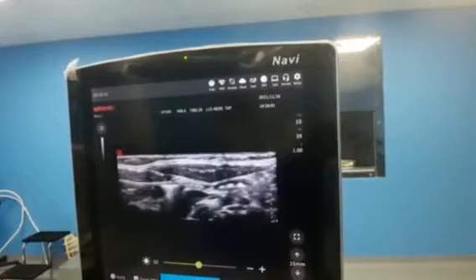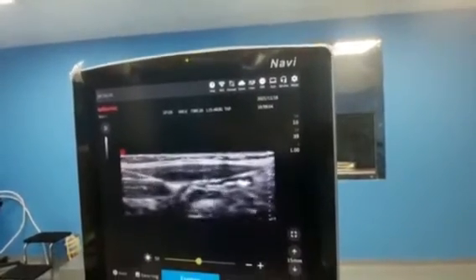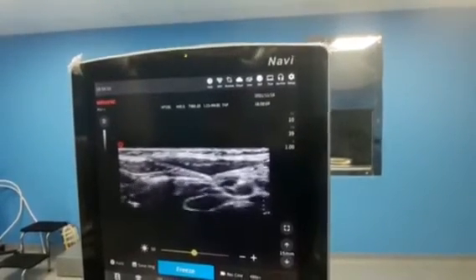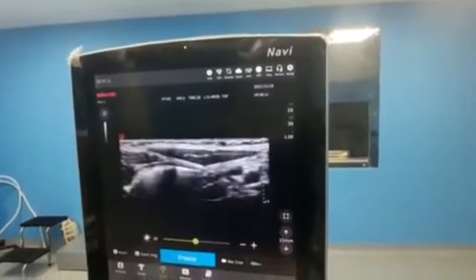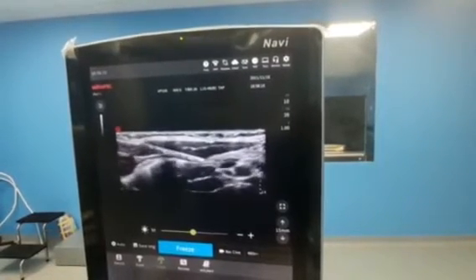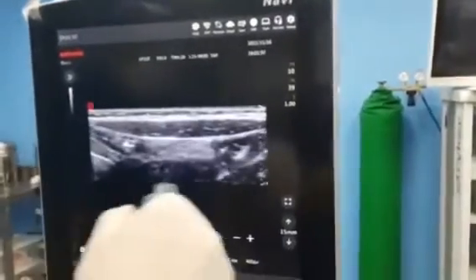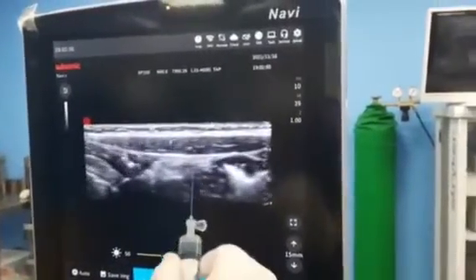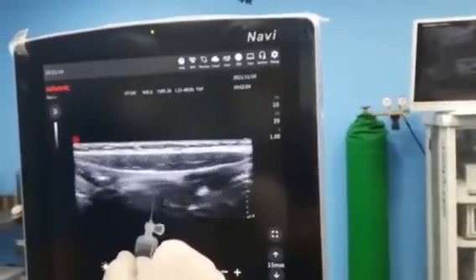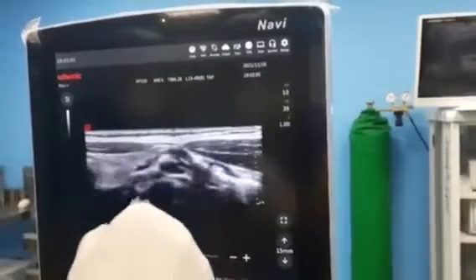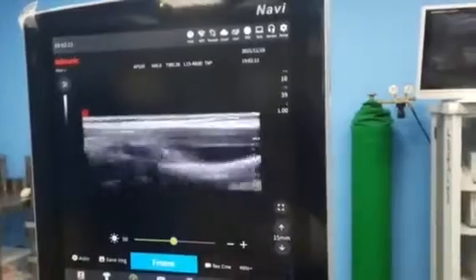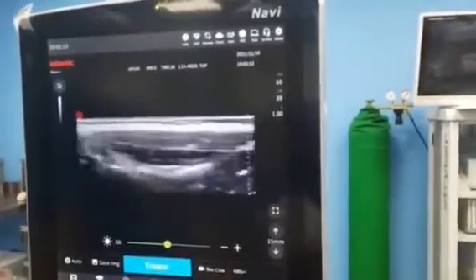I am now at the anterior aspect of the muscle. You need always to do aspiration for security. You have the different elements: the rectus sheath and the linea alba between the two rectus muscles.